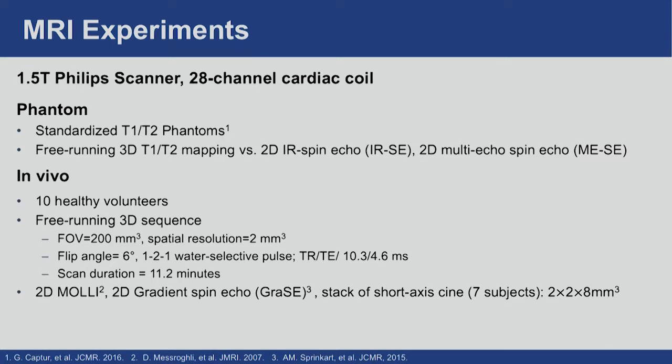For in vivo T1 and T2 reference, the 2D MOLLI and the 2D gradient spin echo method were performed. And for Cine reference, the traditional stack of short-axis Cine images was acquired on 7 subjects.